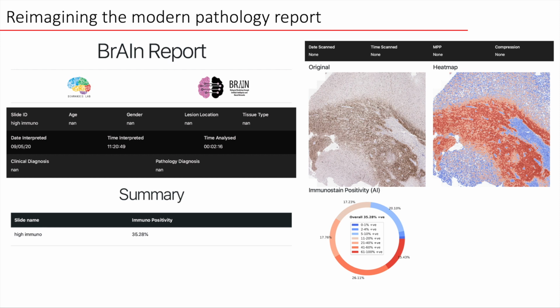This is one of our immunohistochemical reports, and as you can see, it again provides a traditional overall score on the first page, but on the second page, you get these documentations of where the computer detected high proliferative activity, and then you have this pie chart breaking down the percentages of proliferation indices rather than just giving you an overall score. And these may in fact turn out to be a more accurate representation and prediction of how the patient's tumors behave.